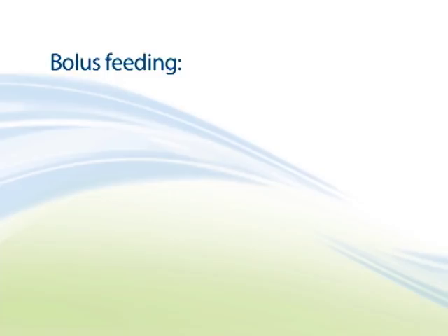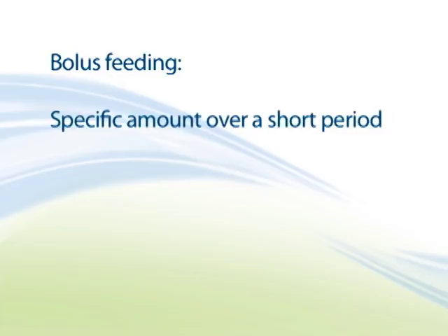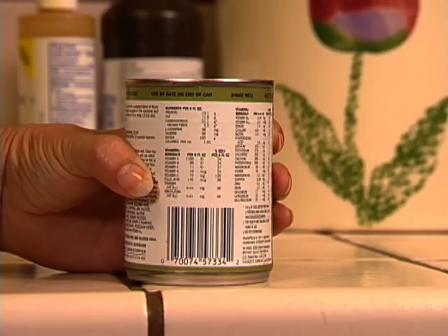The most common method for home tube feeding is bolus or syringe feeding. This is when a bolus, or specific amount of formula, usually one can, is given over a short period of time. You can think of it as giving yourself a liquid meal down your tube 3 to 4 times a day or as prescribed by your physician.